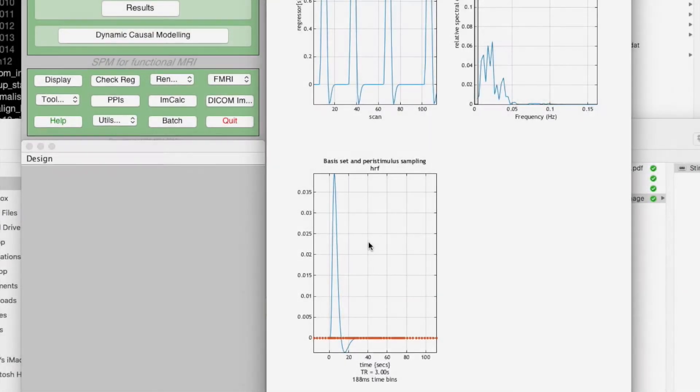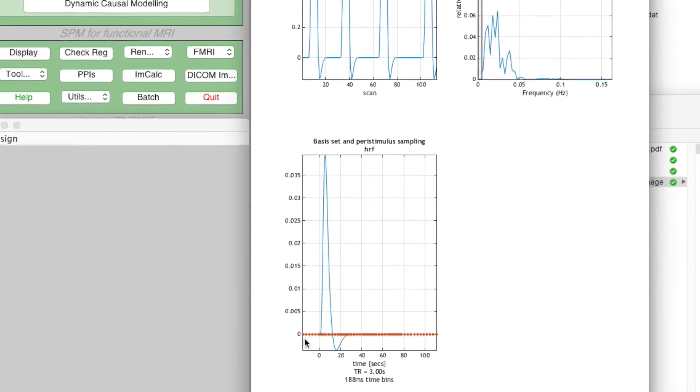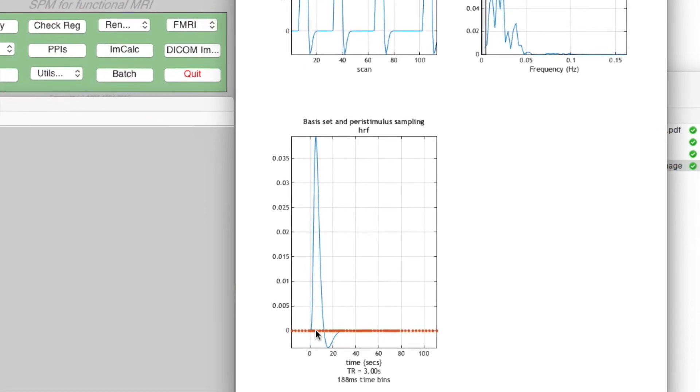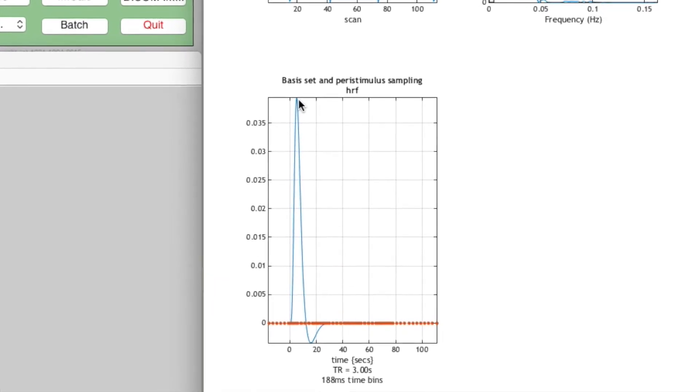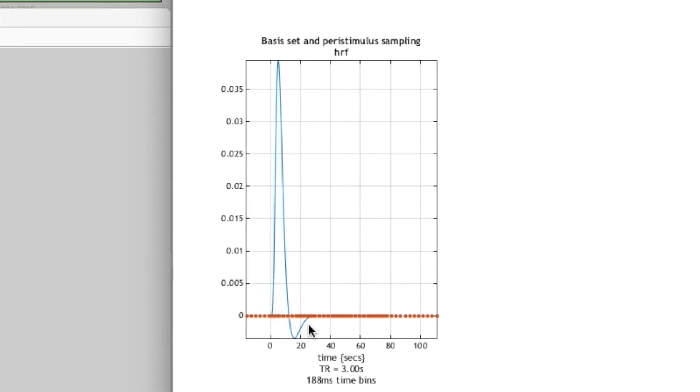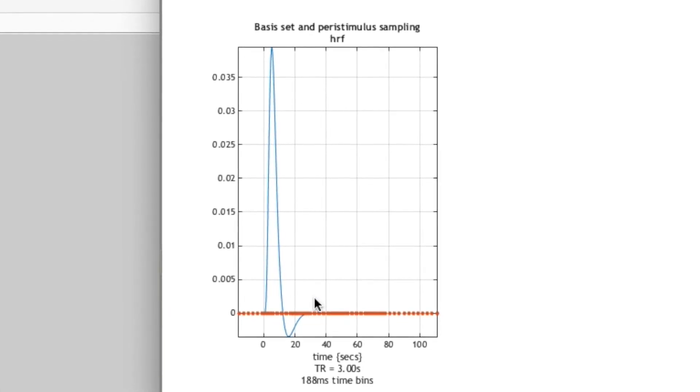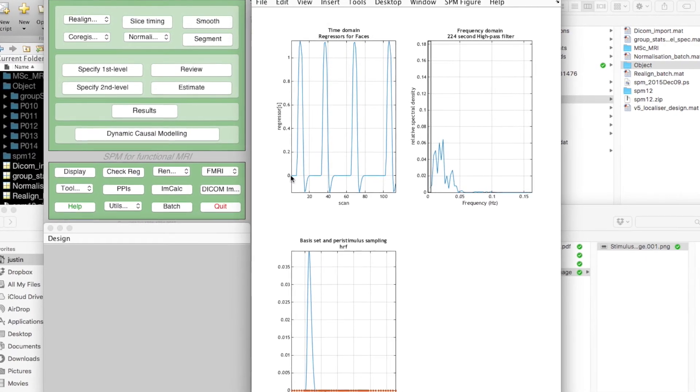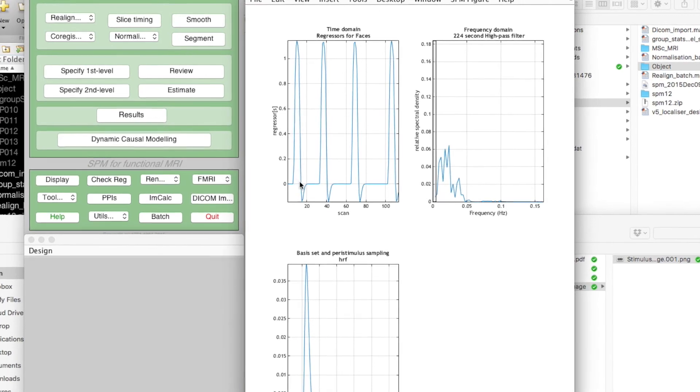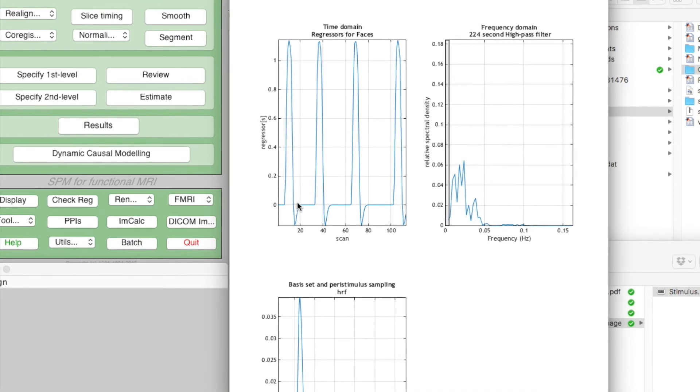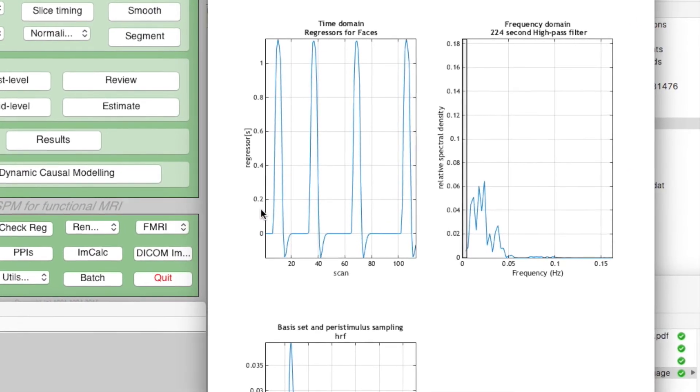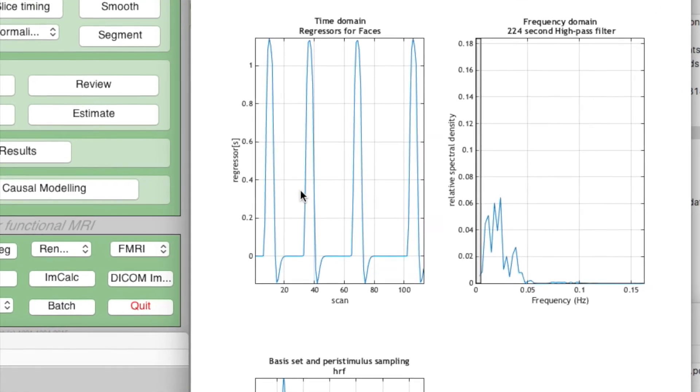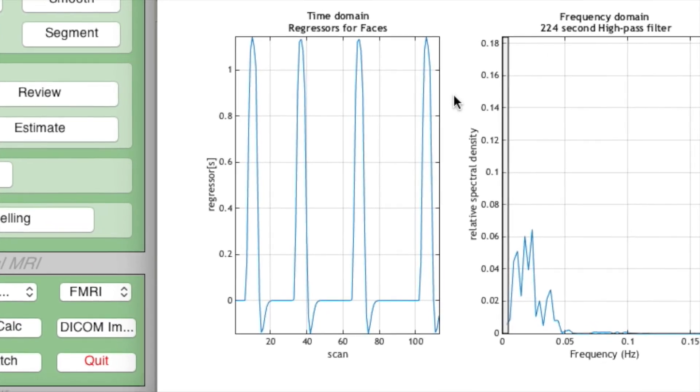We've used the canonical hemodynamic response function. That is a peak in the BOLD that comes up about five seconds after the change in your activity, then it descends and undershoots and returns to baseline after about 30 seconds. That's convolved with a square wave boxcar function to give this kind of effect. You can see this is the model it's going to try to fit to the time course of every voxel by adjusting the beta, the height of it, and an uninteresting constant. We can see the four peaks corresponding to the four times when the face block came on.